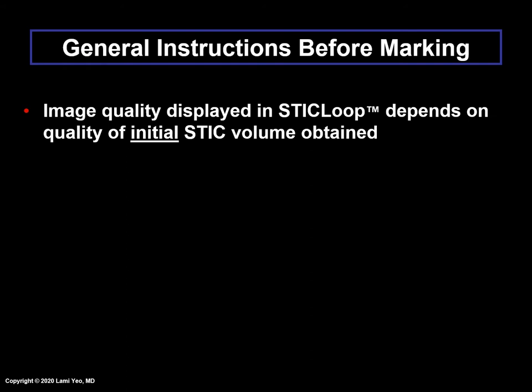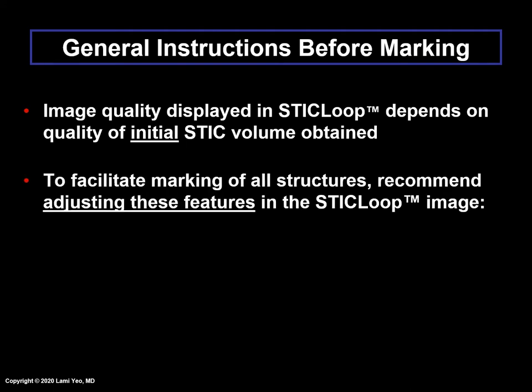The image quality displayed in STICLoop depends on the quality of the initial STIC volume obtained. If the volume has generally poor image quality in which structures are not very clear, this will also be the case for the image quality in STICLoop. This is because the system automatically converts the STIC volume into STICLoop, a two-dimensional cine loop that scrolls in a continuous fashion. To facilitate marking, we recommend adjusting brightness, mid-tones, and contrast based on user preference.